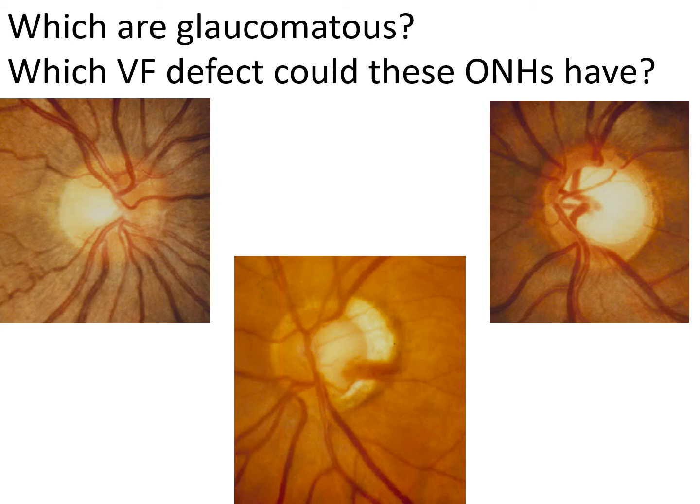We have a thin rim, probably thinner in the inferior pole, together with some changes of the lamina cribrosa that you can see, and the peripapillary area in the temporal sector. And in the third image, there is a large disc with a large excavation, but the rim is well defined all around the disc. The excavation could be something abnormal or just a physiological change.